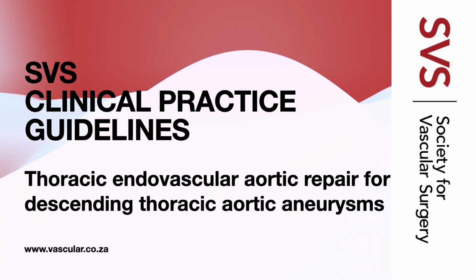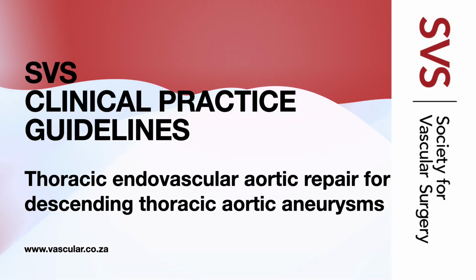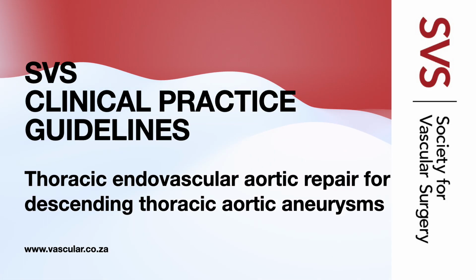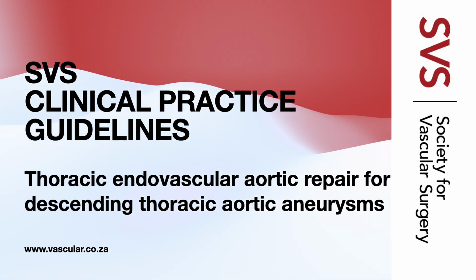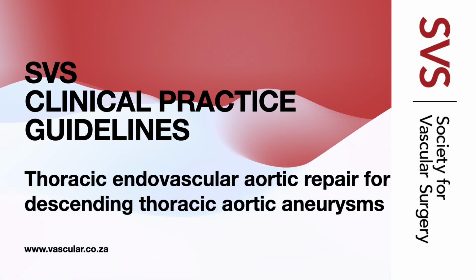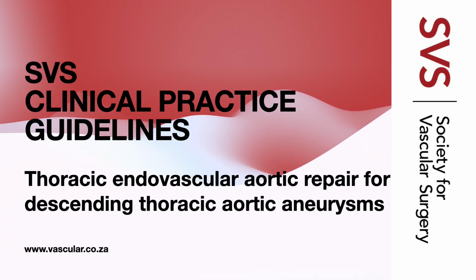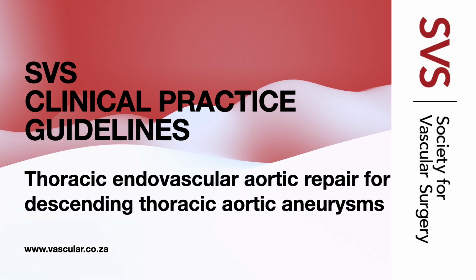Okay, so once a DTAA is found, how do doctors actually plan the repair? You mentioned fixing it from the inside. That must need a really good map, right? Yeah. Absolutely. That's where imaging is just critical. Before TEVAR, you'd get detailed scans, computed tomography angiography, or CTA scans. Think of them like getting ultra-precise blueprints of your arteries. They look at the whole aorta, arteries in your head, neck, legs. It lets the team plan meticulously, choose the right size stent graft, everything.